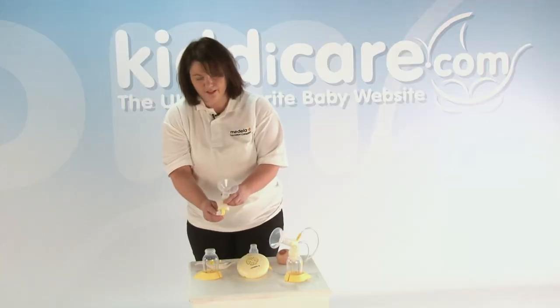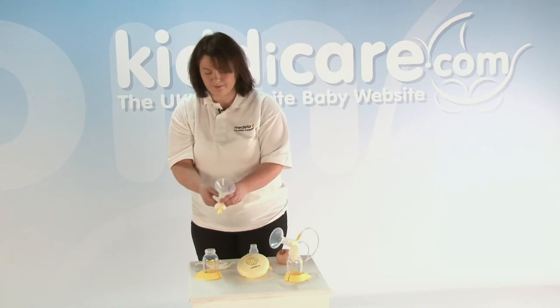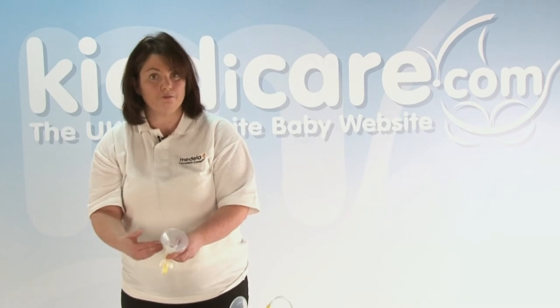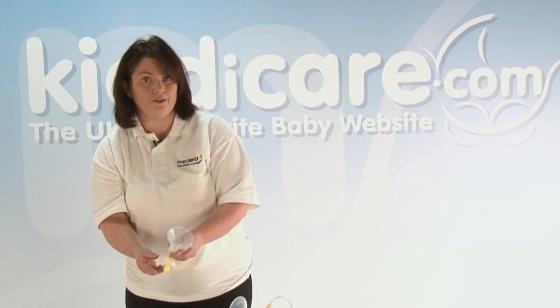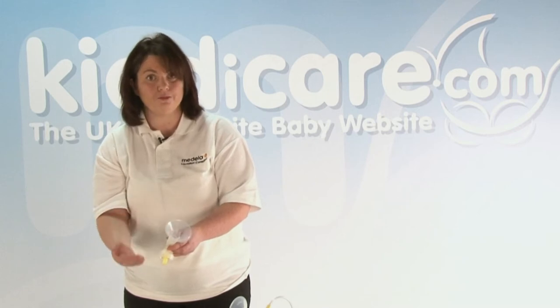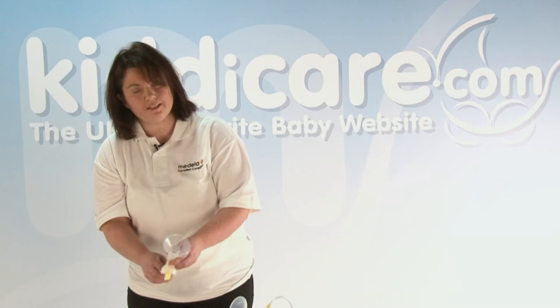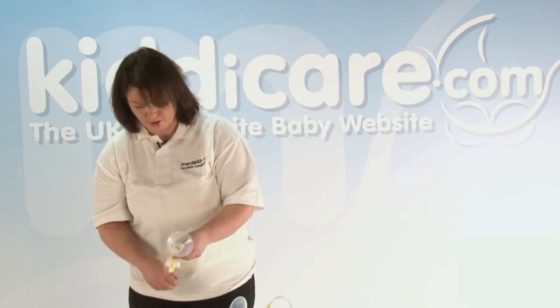Have it facing either left or right. Now you'll think, well, why is that? If you have it facing you and you've got a lot of milk flowing, then this valve doesn't close effectively, because it needs to be able to open and close with the vacuum and the cycle of the pump. So if you've got a lot of milk, sometimes it might be intermittent. Turning it sideways on may help the milk drain better into the bottle.